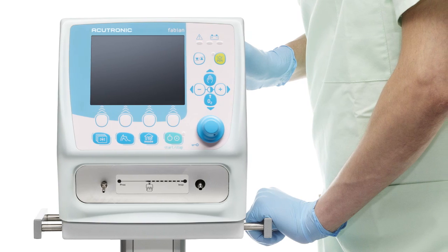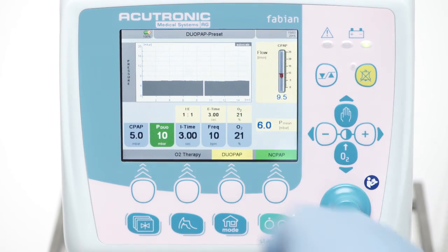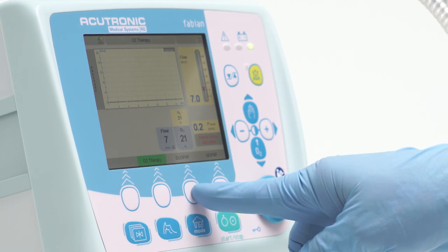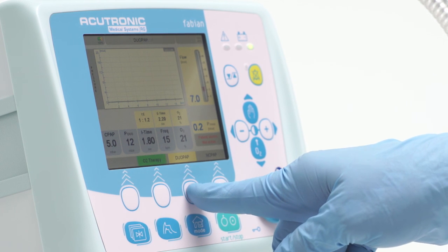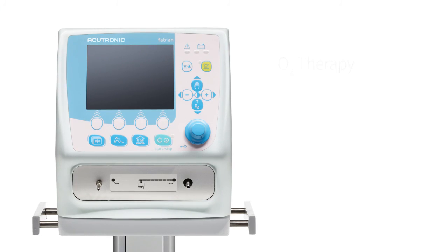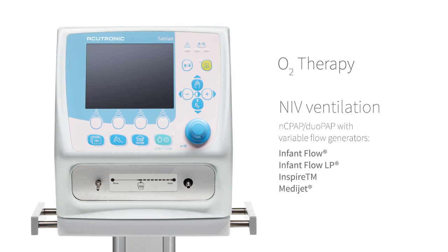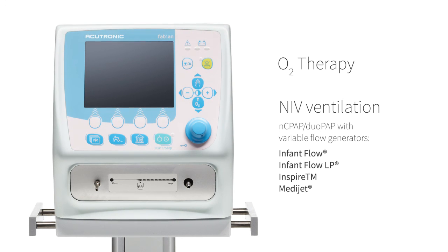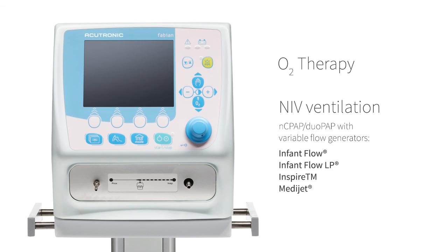The Fabian Therapy Evolution ventilates with excess pressure based on the continuous flow principle and features the following non-invasive ventilation methods: O2 Therapy, NIV Ventilation, NCPAP, DUO-PAP with variable flow generators like InfantFlow, InfantFlow LP, Inspire TM, and MediJet.